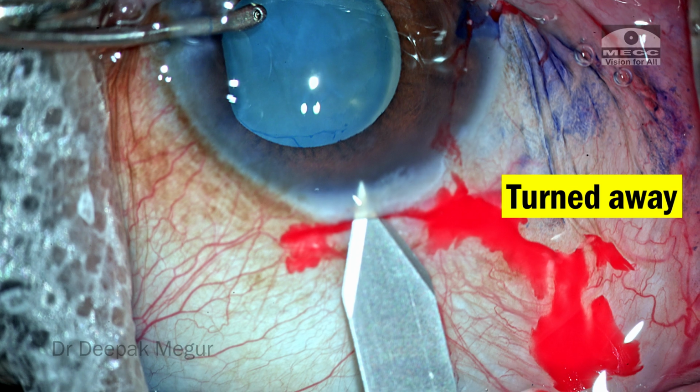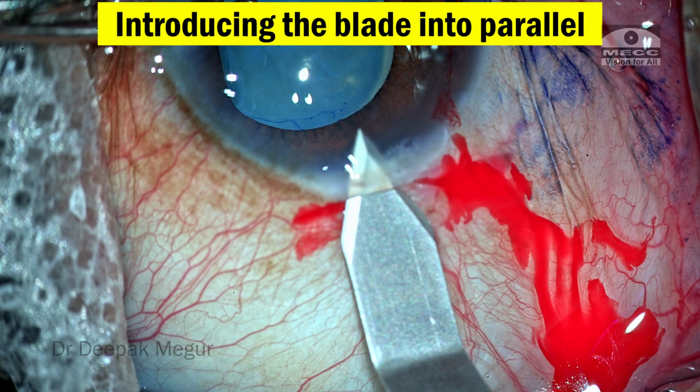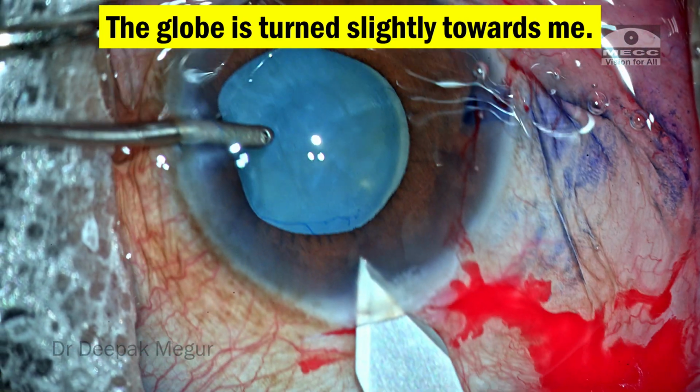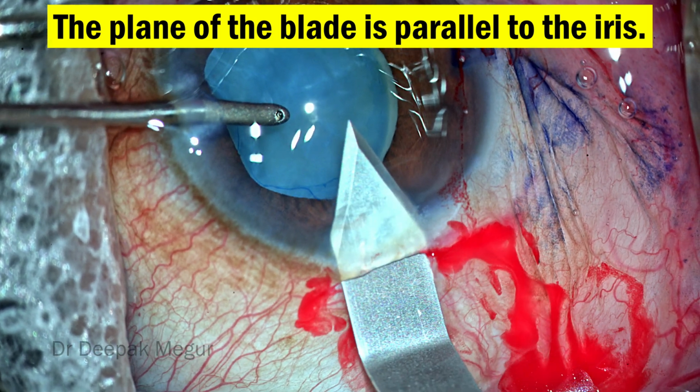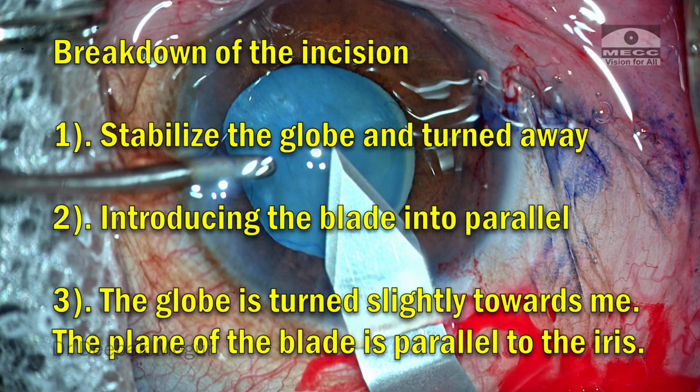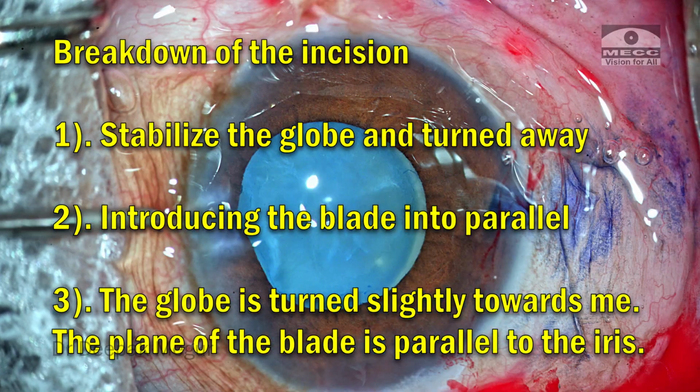So to revise, the globe is turned away, you enter into the eye, the globe is turned a little bit towards you, and then you perforate into the chamber with the blade being parallel to that of the iris. The incision is broken down into maybe 3 maneuvers.